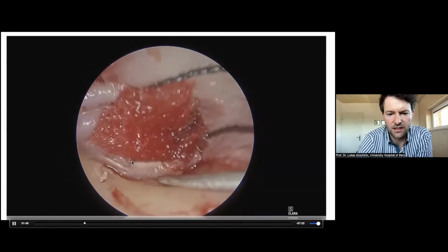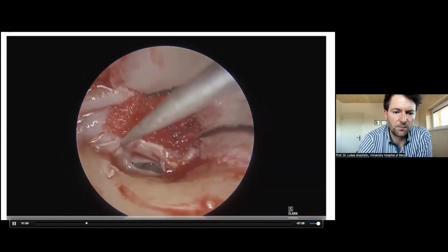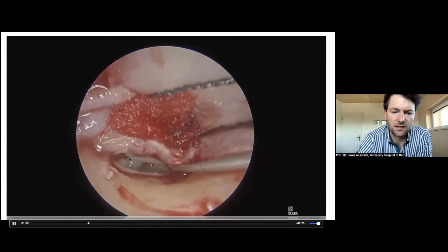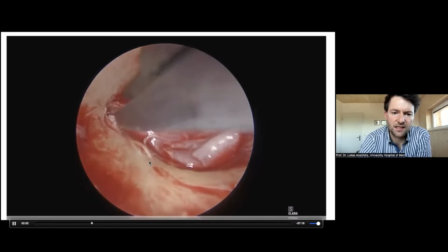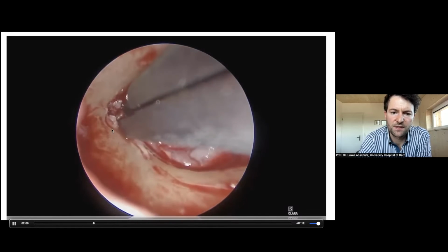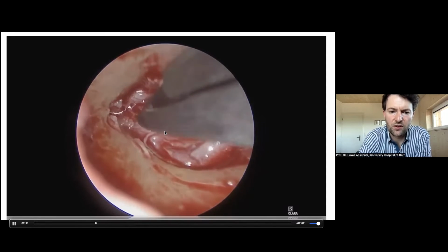I usually lift up the mucosa like this and follow the plane of the chorda tympani. You can see here the chorda tympani. This is the incudostapedial joint, the round window already here. We already have a good overview. Now we dissect the cholesteatoma out of the flap. Again, here the hole in the flap is quite small, but we can free the cholesteatoma here.